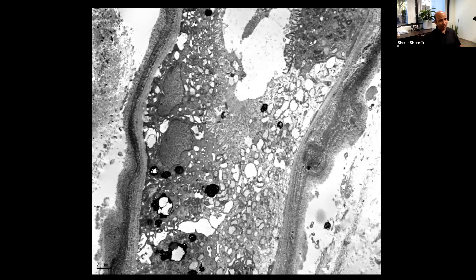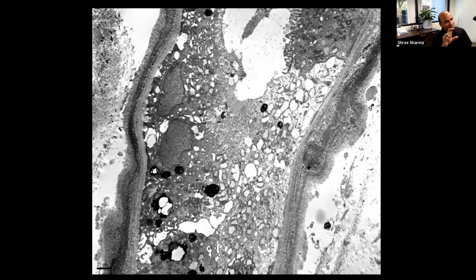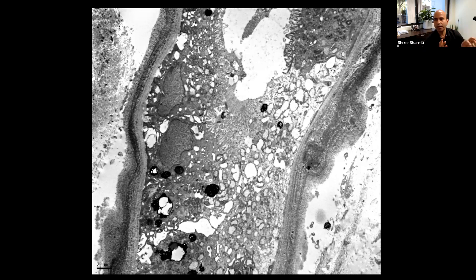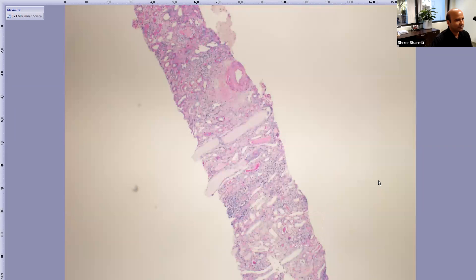On the toluidine blue thick section for EM preparation, rhomboid crystal structures are visible in the tubules — these are crystals in LCPT (light chain proximal tubulopathy). This is distinct from Fabry disease, which is another diagnosis that comes to mind with similar-looking structures on toluidine blue. The rhomboid shape of the crystals can be appreciated on the individual crystal structures visible in the image.